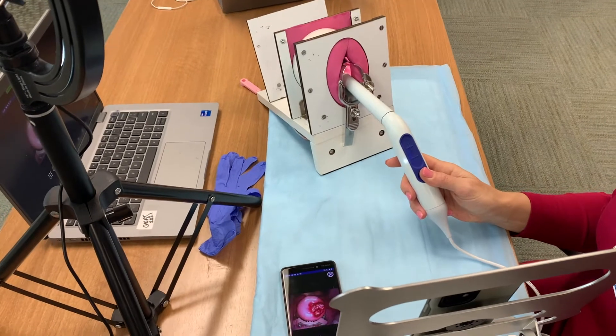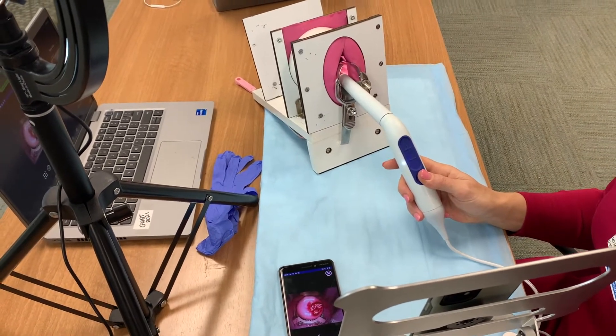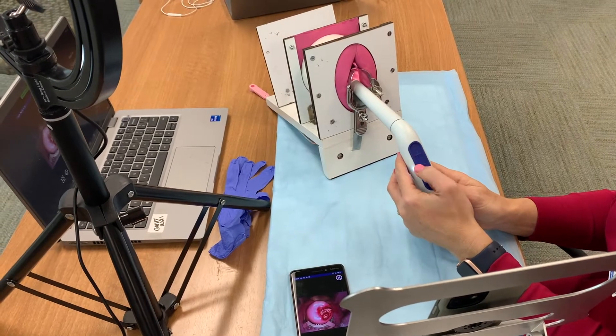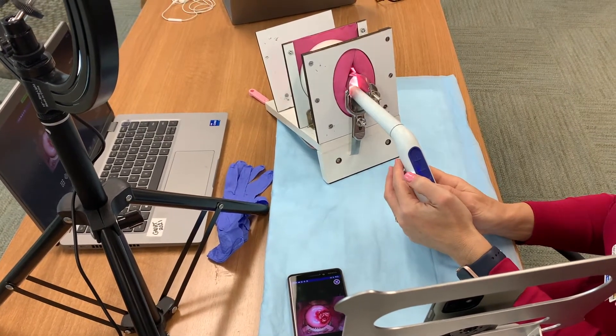I move it to the cervix until I'm about three centimeters away, and then I have a clear view. At that point, if I'm satisfied with the zoom, I just switch to the green filter.